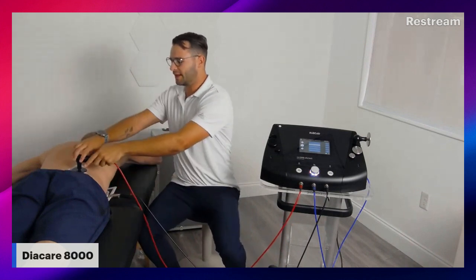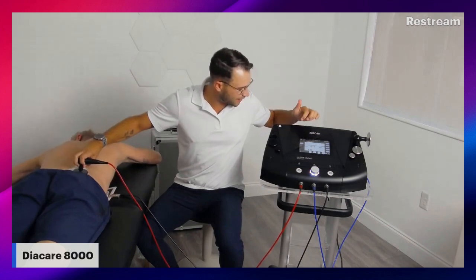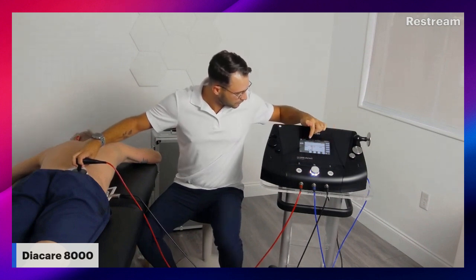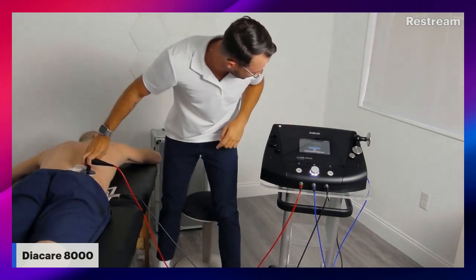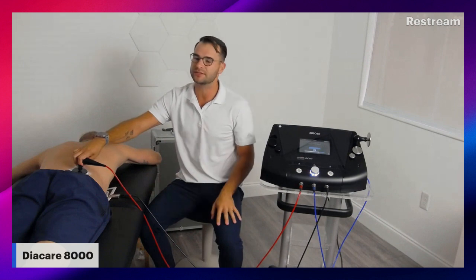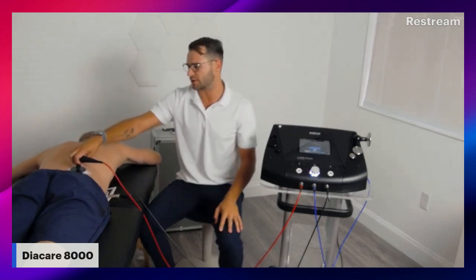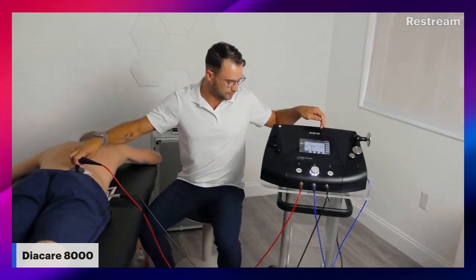So once the head of the active electrode is placed on the body, the important thing we're going to do is we're going to calibrate. What is calibration for a TECAR machine or for the Diacare specifically? When we calibrate, we go ahead and we're starting, and it's measuring the impedance of your patient's body. So this is going from the return plate to the active, and we're making sure that there's not going to be any zips or charges throughout the body. So we're protecting the patient, making sure they're very comfortable.